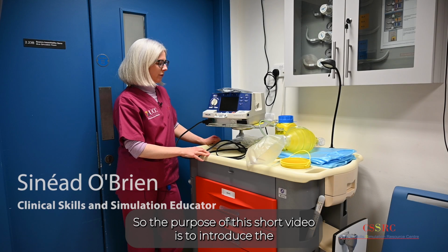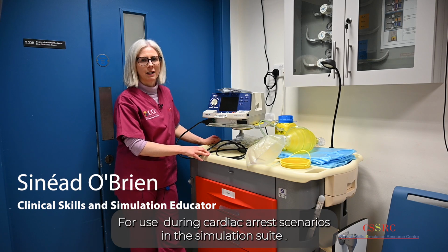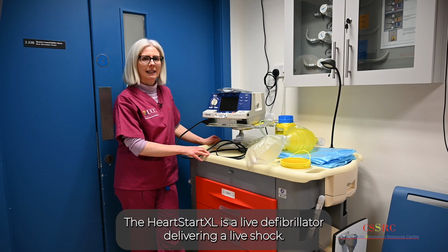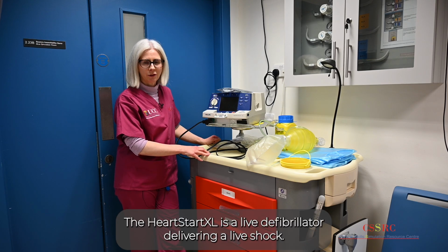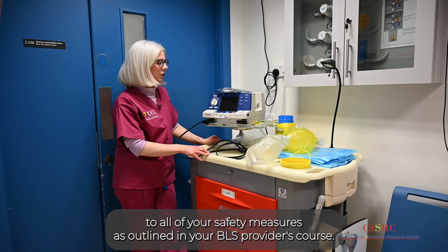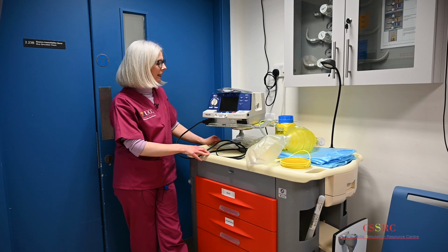So the purpose of this short video is to introduce the HeartStart XL as an AED for use during cardiac arrest scenarios in the simulation suite. The HeartStart XL is a live defibrillator delivering a live shock. So when in use during scenarios, it is important that you adhere to all of your safety measures as outlined in your BLS provider's course.